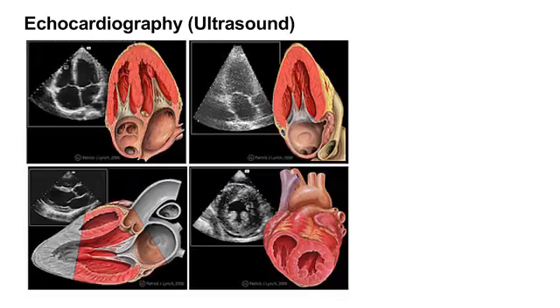It shows wall motion abnormalities, which can be caused by blocked coronary arteries. Therefore, it is helpful in patients with non-diagnostic ECG changes and ongoing chest pain. On the downside, there is a relatively short time frame in such chest pain patients to show those wall motion abnormalities. Sometimes the acoustic window is poor and the imaging quality is bad, sometimes in obese patients. Also, it needs a lot of operator experience to analyze these images.